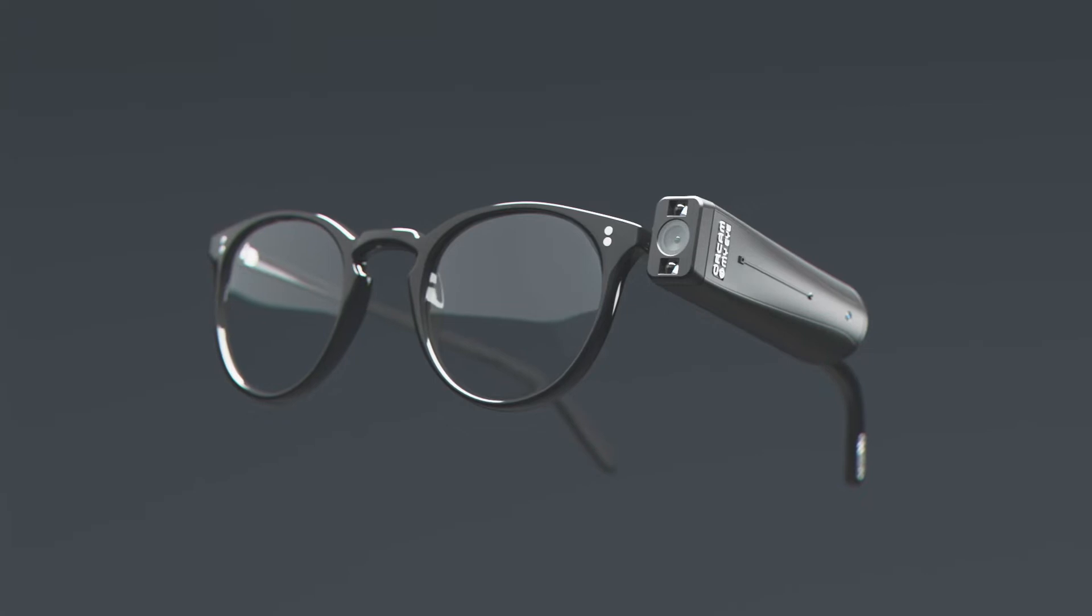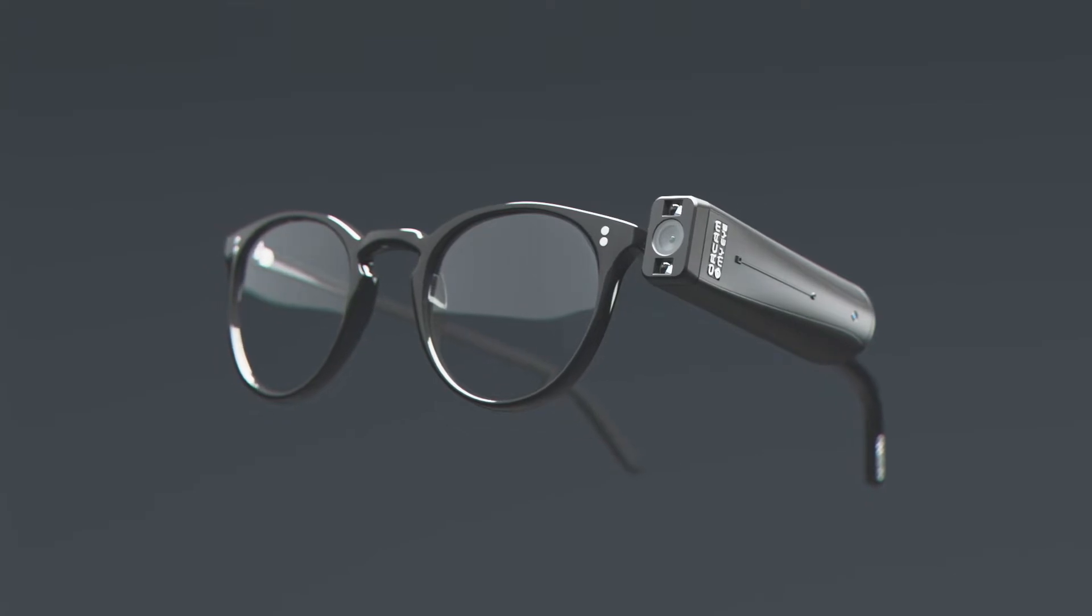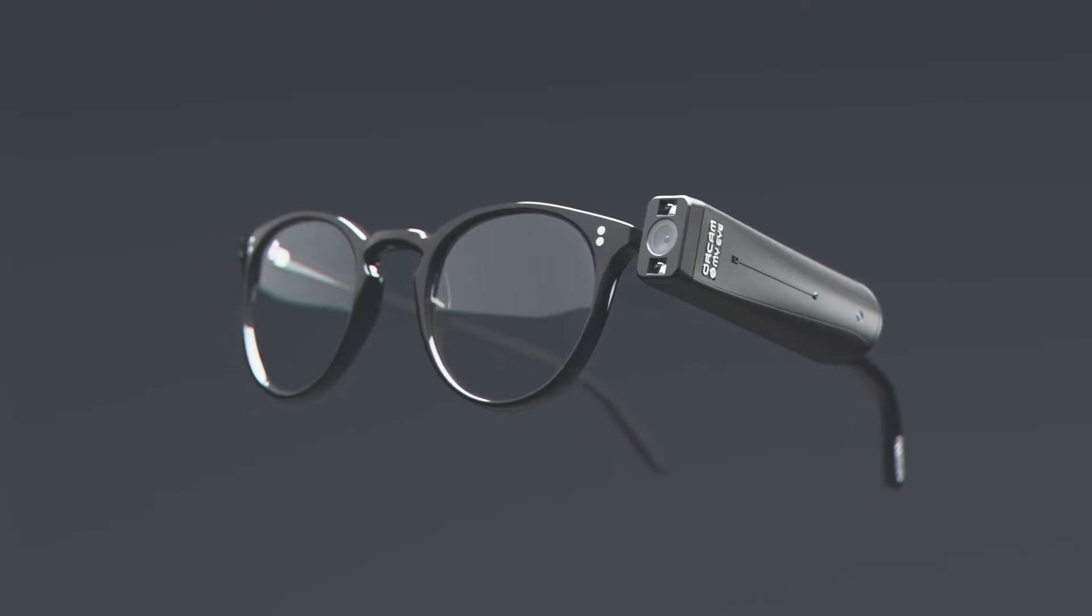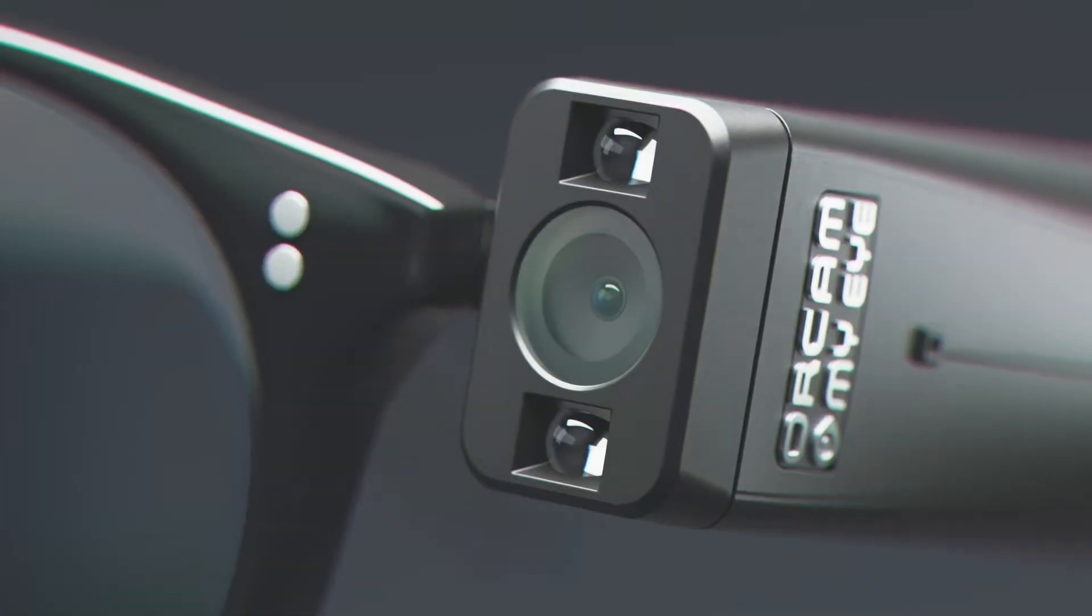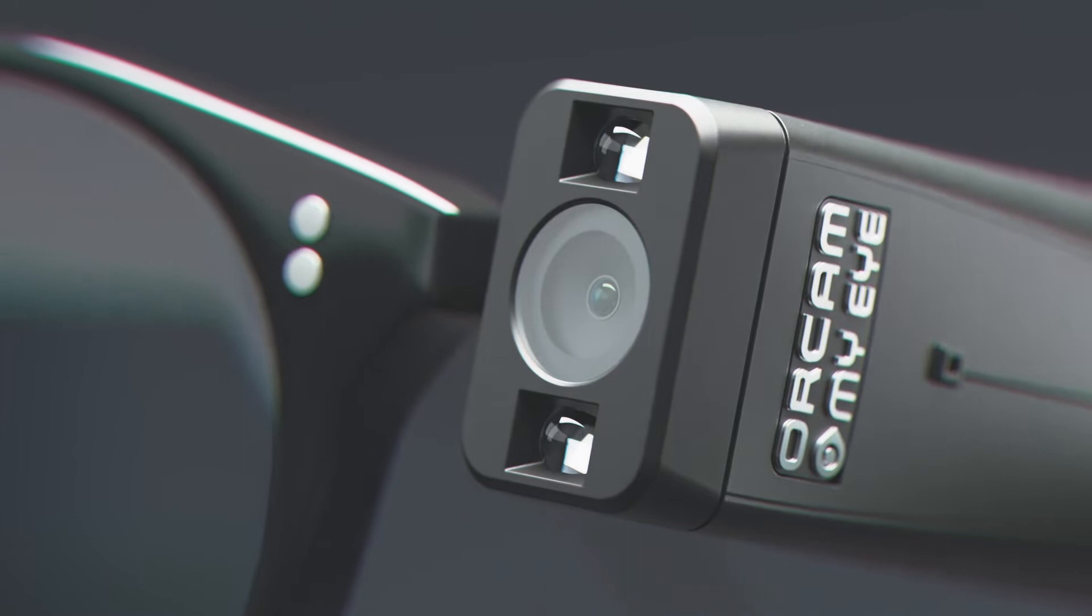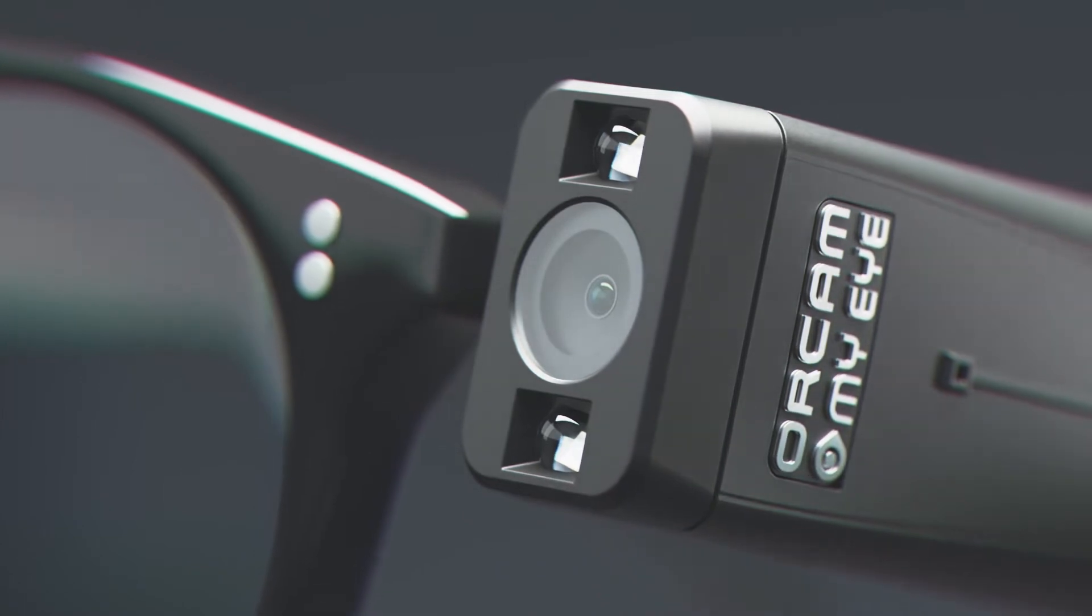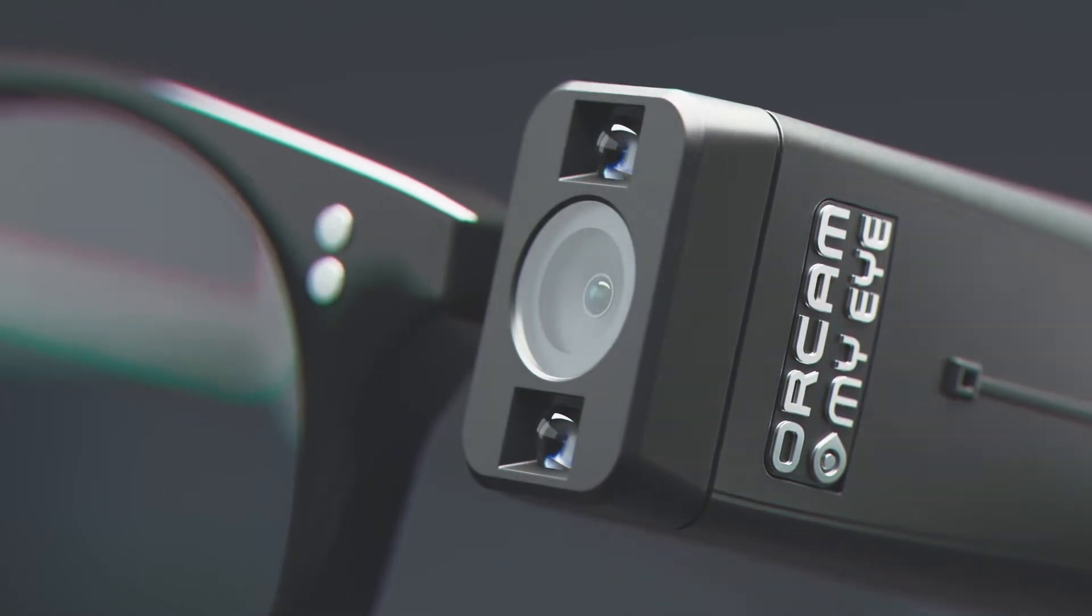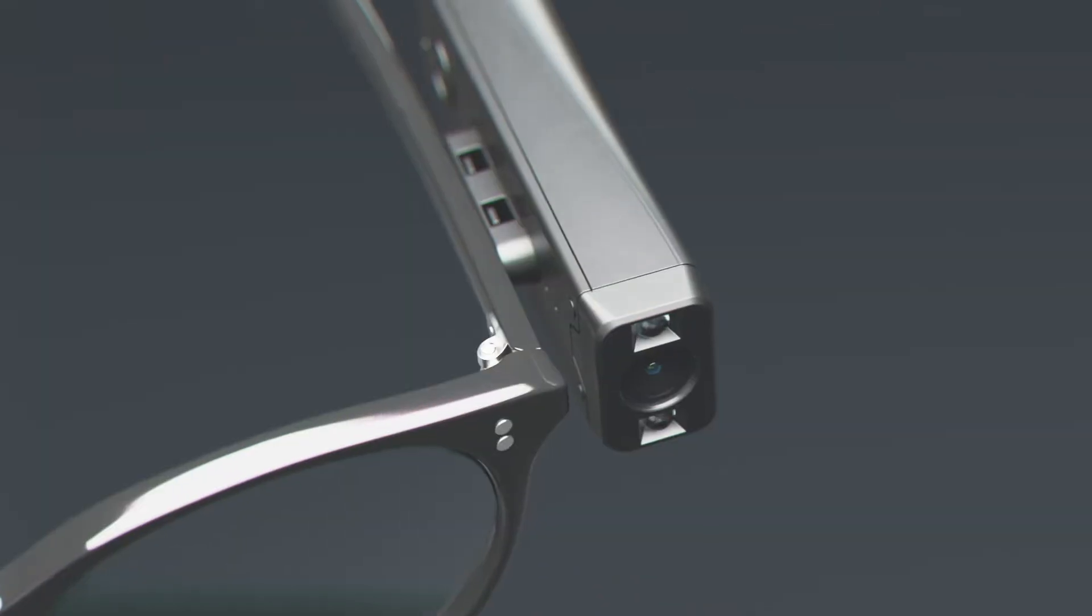Introducing the OrCam MyEye wearable device, the globally award-winning breakthrough solution for people who are blind or visually impaired.